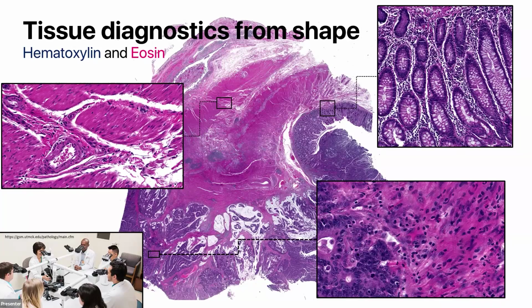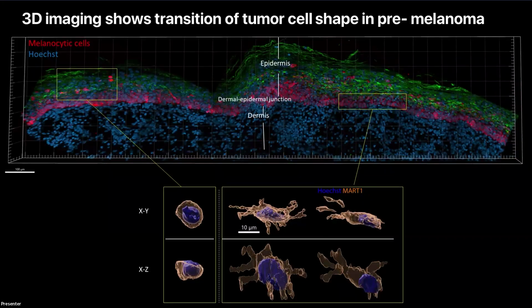Here are 3 areas of a tumor showing muscle, an organized healthier area, and a disorganized tumor region. Clinicians undergo a lot of medical training to visually recognize these as part of diagnostics. So surely there must be something useful that we can learn here to incorporate into our analysis. Let's turn our attention back to our familiar melanoma sample.